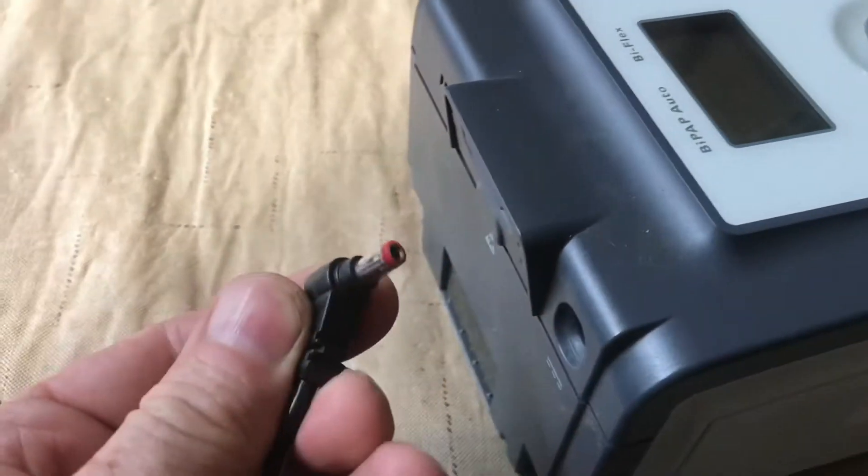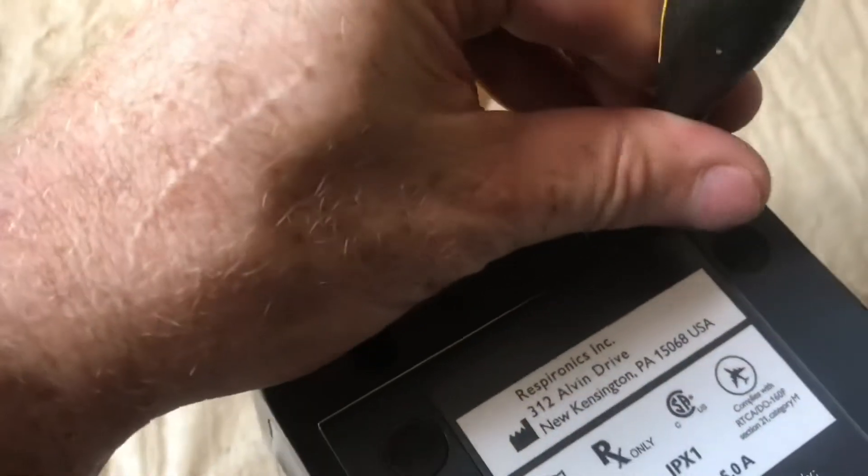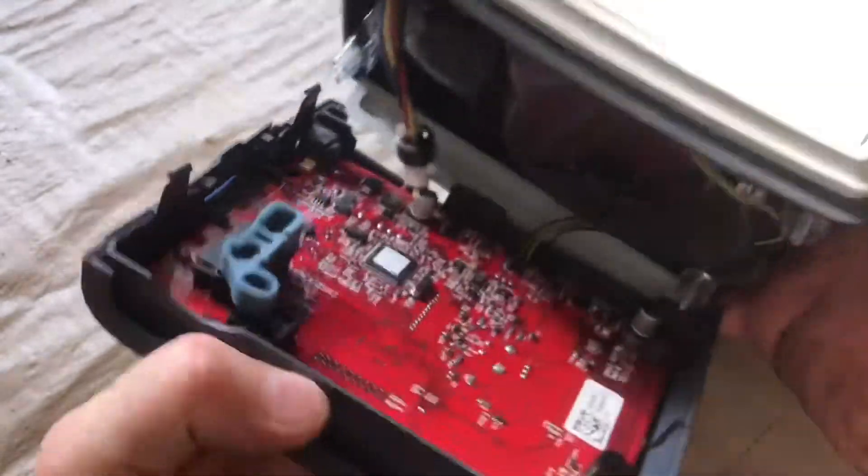Unplug the unit. With the T10 star bit, remove these two screws in here. When these screws are loosened up, you can go ahead and pull this apart.